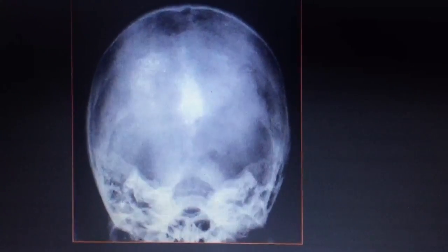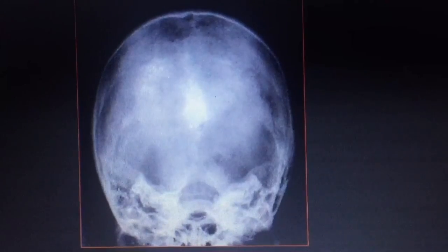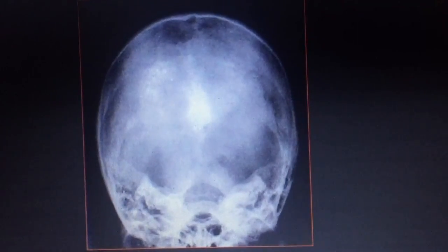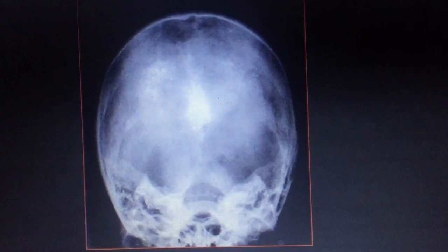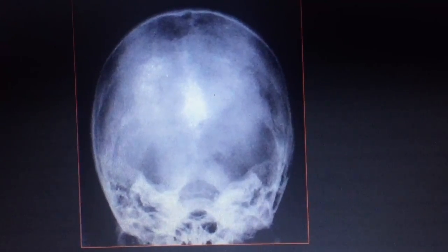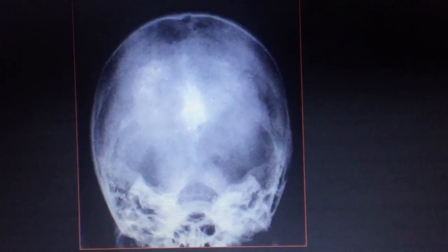Also that there are symmetric petrous pyramids, that the dorsum sellae and posterior clinoid processes are visible within the foramen magnum. Also that the penetration of the occipital bone without excessive density at the lateral borders of the skull is seen. The image contains all of the evaluation criteria and is deemed acceptable.